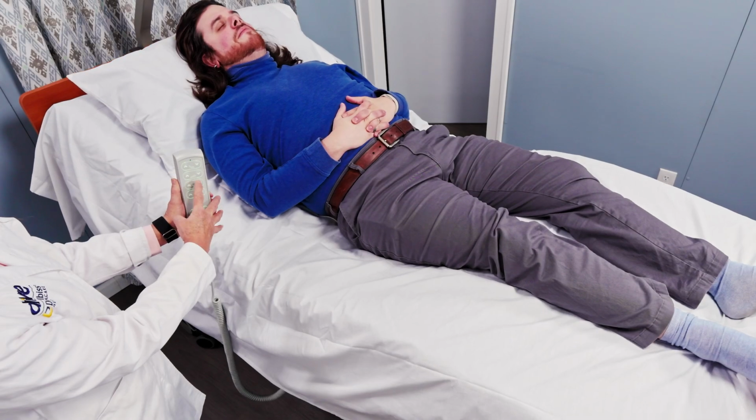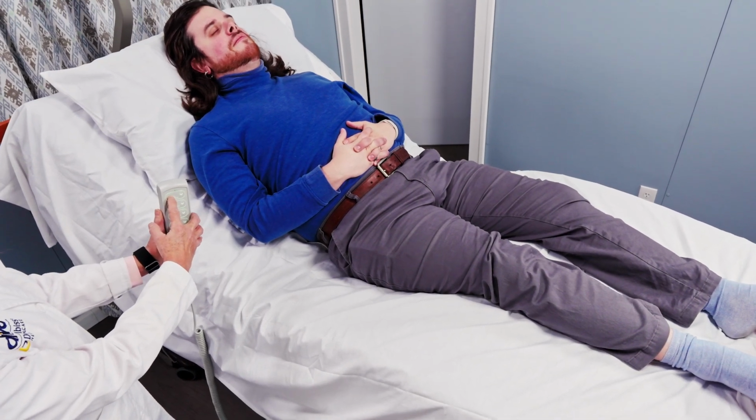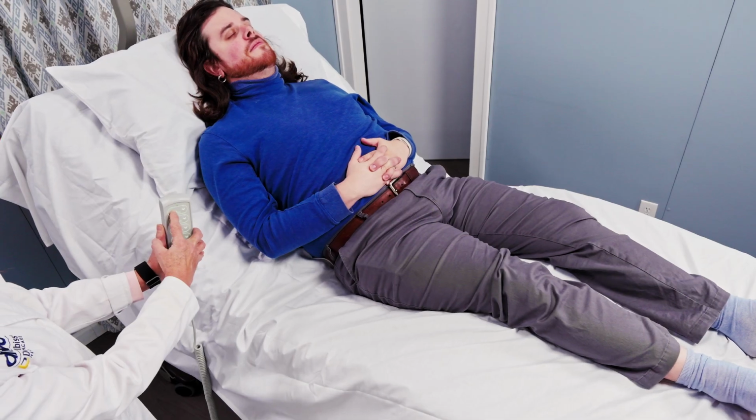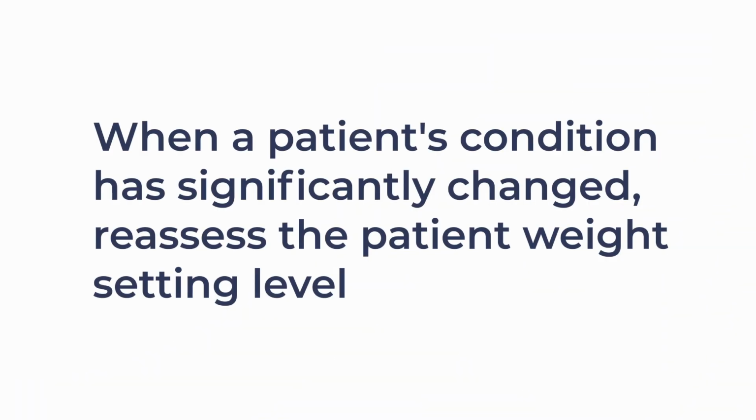If a patient prefers a firmer or softer mattress, increasing or decreasing the setting to ensure proper pressure redistribution, patient support, and comfort is correct practice. When a patient's condition has significantly changed, reassess the patient weight setting level.